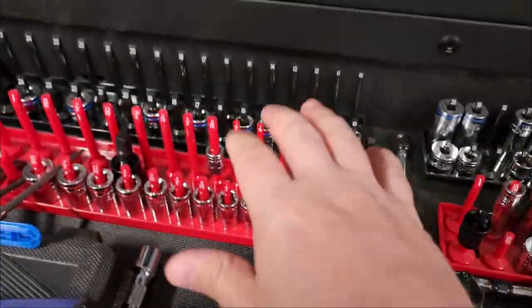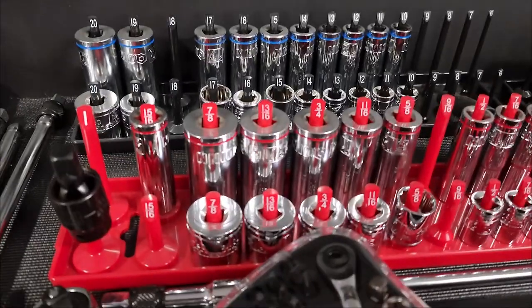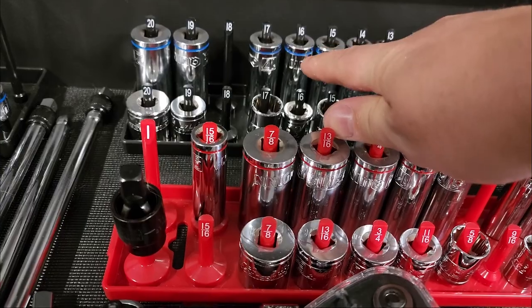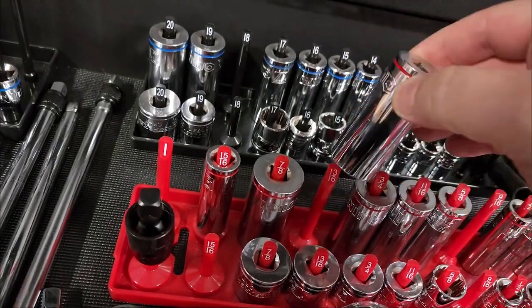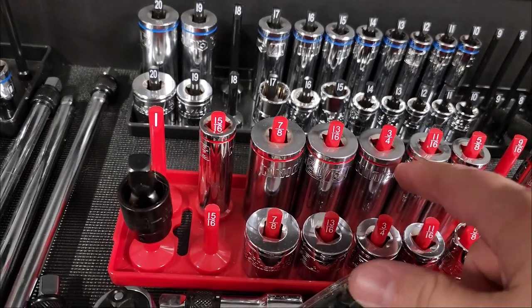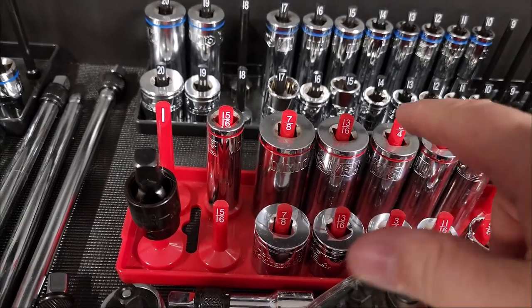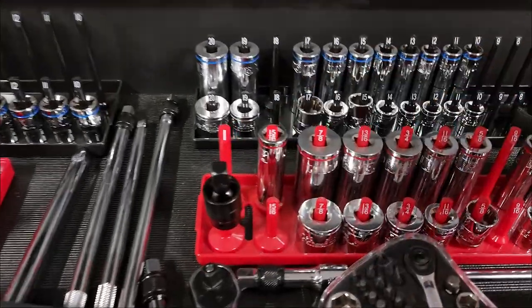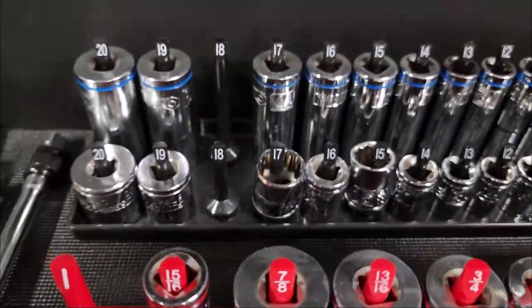The first thing you should know is that there are metric and standard sockets. Some companies choose to show that with different color bands, which is very cool because you can end up with both in the same tray — especially with medical equipment. These Icon brand sockets from Harbor Freight have color-coordinated bands: blue equals metric, and the others are standard.